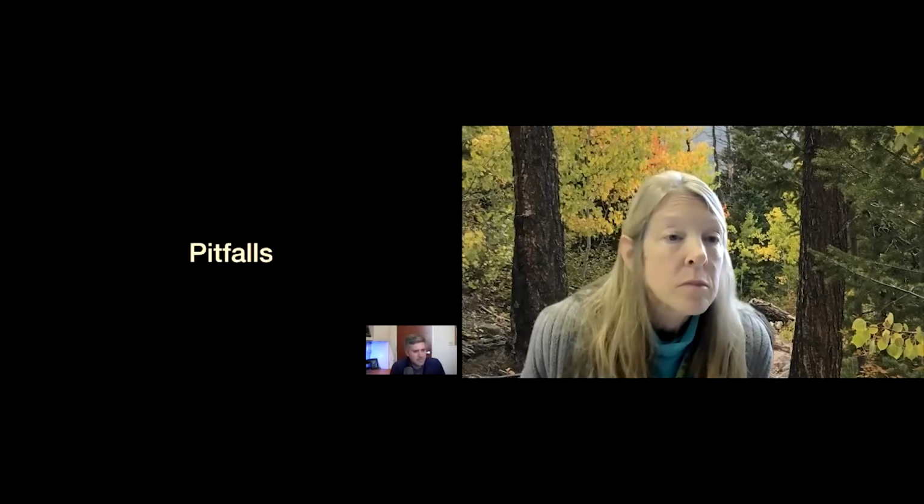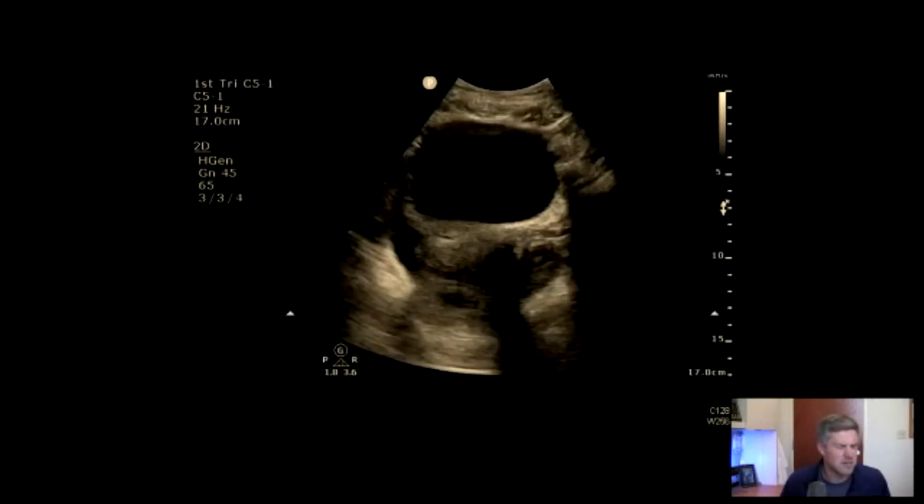So with that being said, let's talk through a couple pitfalls. And these are cases that we've seen down in the ED where patients have scanned a bladder and something has gone amiss in terms of the bladder scan, right? Recognizing it or doing something like that. So case number one, this is going to be a young female patient presenting, let's say, with pelvic pain, right? I think the presentation is probably less important than the sonographic image in this certain circumstance.